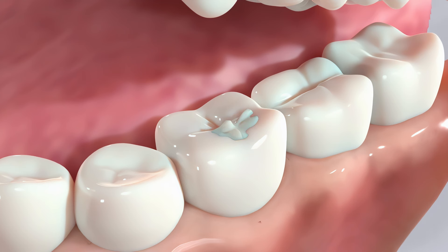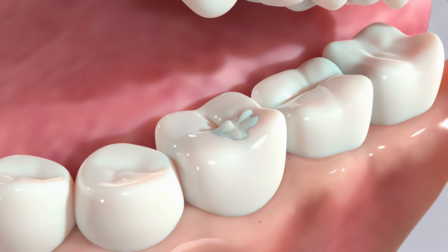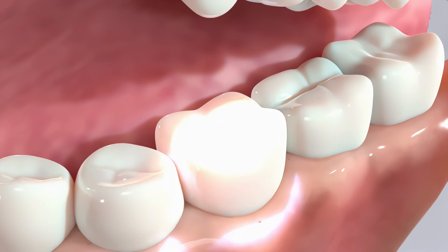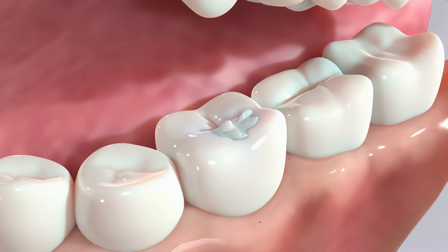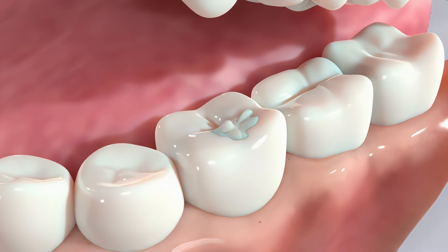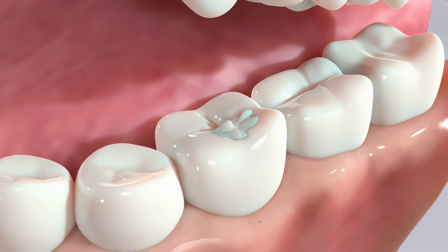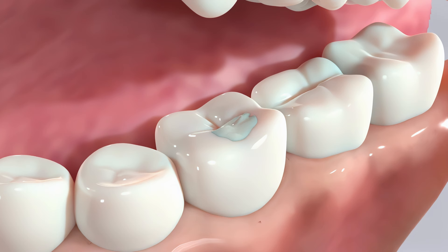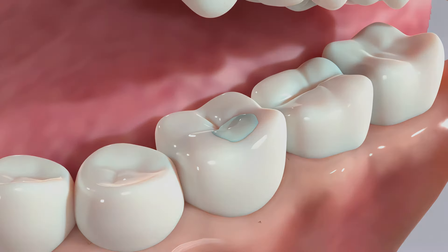Next, your dentist will set the composite material with a curing light. This quickly hardens the material, ensuring a long-lasting and durable restoration. To finish the process, your dentist will polish the filling until it's smooth and comfortable.